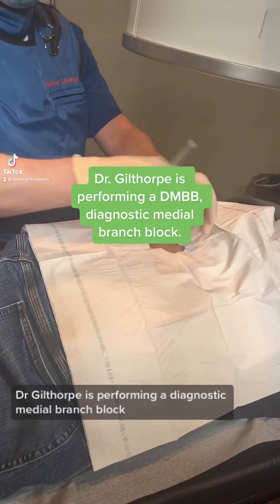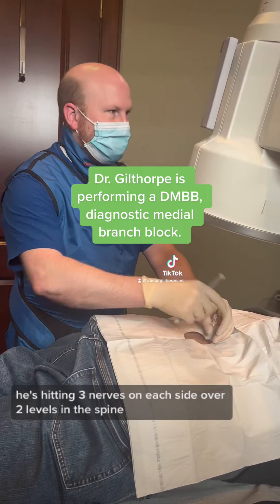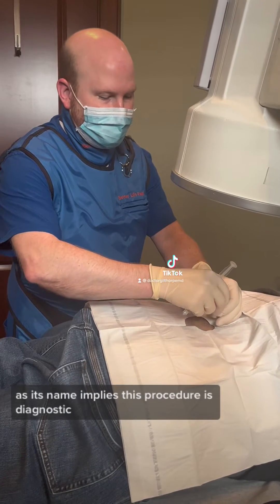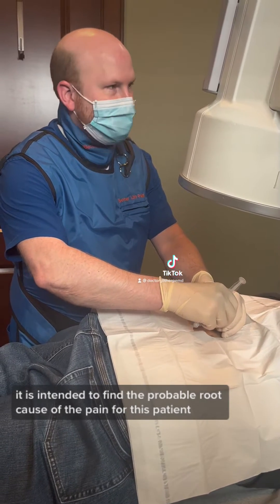Dr. Gilthorpe is performing a diagnostic medial branch block. He's hitting three nerves on each side over two levels in the spine. As its name implies, this procedure is diagnostic — it is intended to find the probable root cause of the pain for this patient.